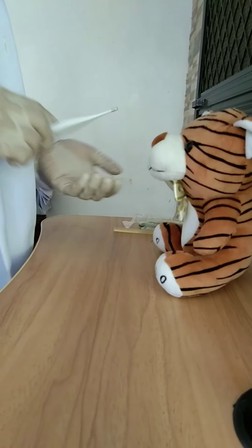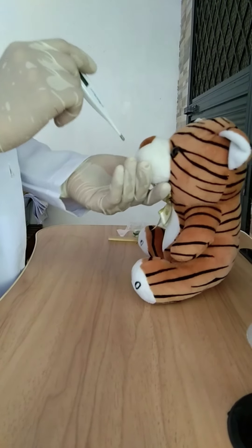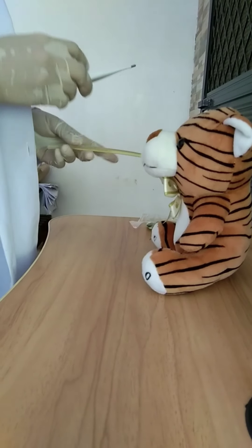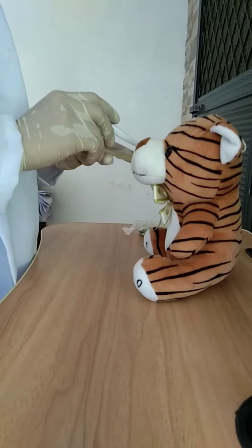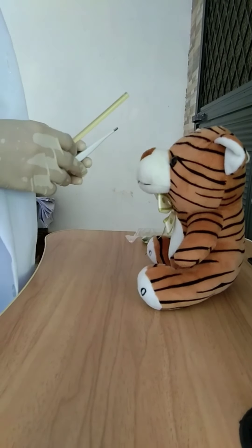Use a penlight to illuminate the posterior pharynx. Then insert the swab without touching any part of the mouth or tongue. Gently but quickly swab the tonsillar area. Remove the swab and do not touch any part of the tongue or mouth.